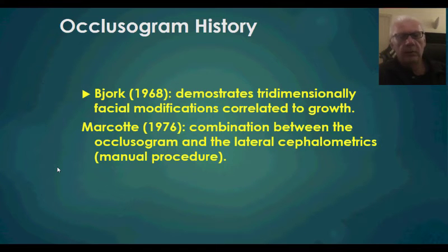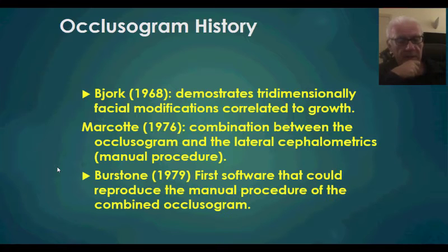And later on, Marcotte defined a procedure in order to combine together the occlusogram, so the occlusal view or the drawing of the occlusal surface of the models, with the lateral cephalometric. All this was done manually, and Professor Burstone in 1979 developed a first software that was able to reproduce the same procedure with the computer.